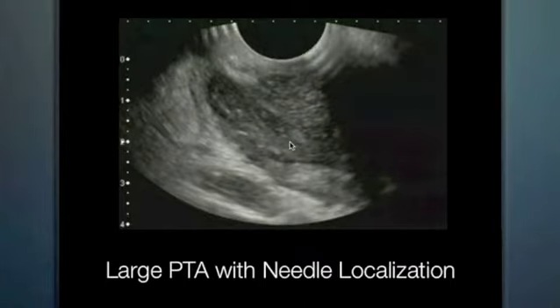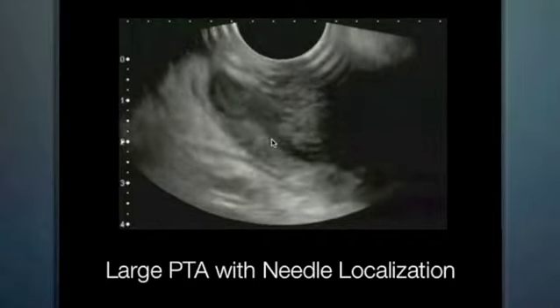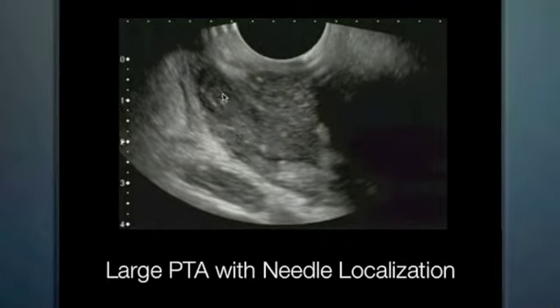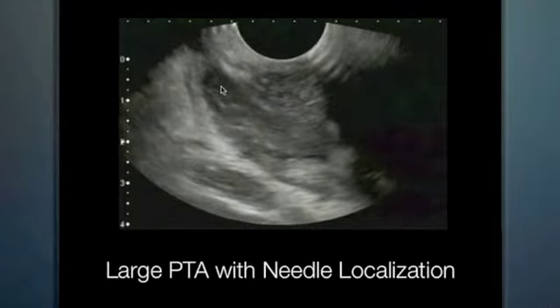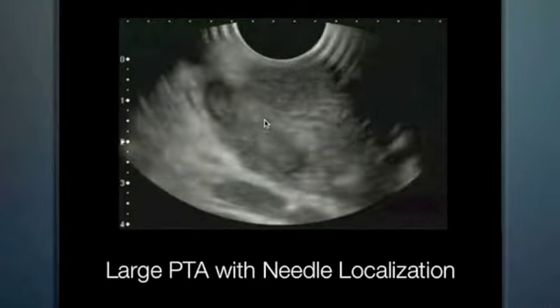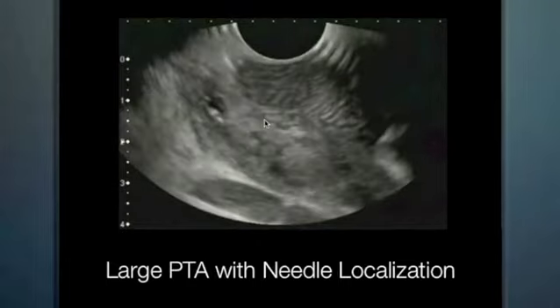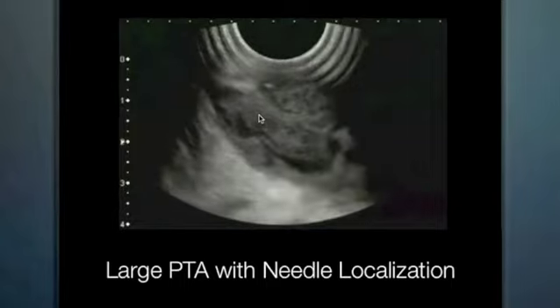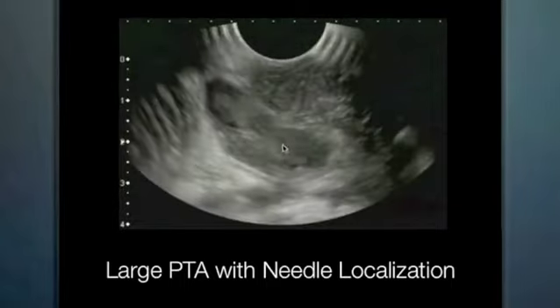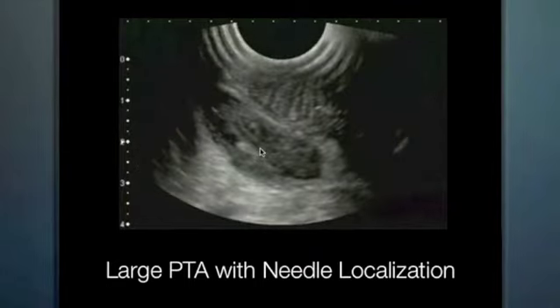With this very severe degree of peritonsillar abscess, you may find that some of these are so large that they're very easy to drain, or that they're so extensive that they may need to be drained in the operating room for maximum comfort and securing of the airway. However, ultrasound does help to differentiate how difficult or easy a drainage procedure could be. And we can localize the needle.